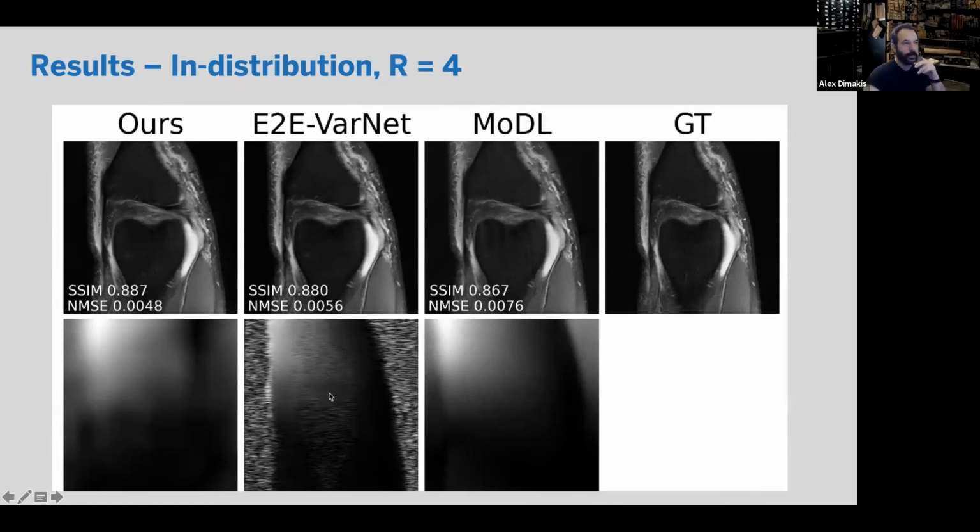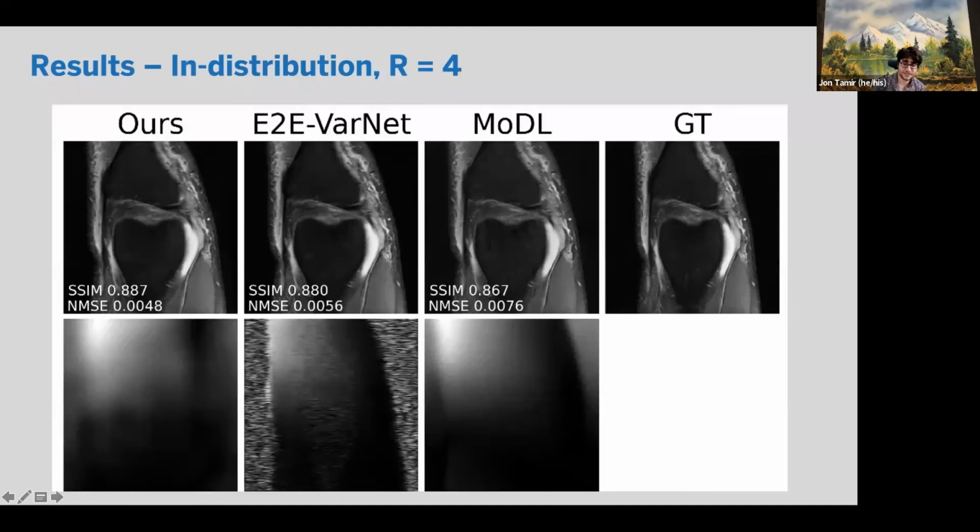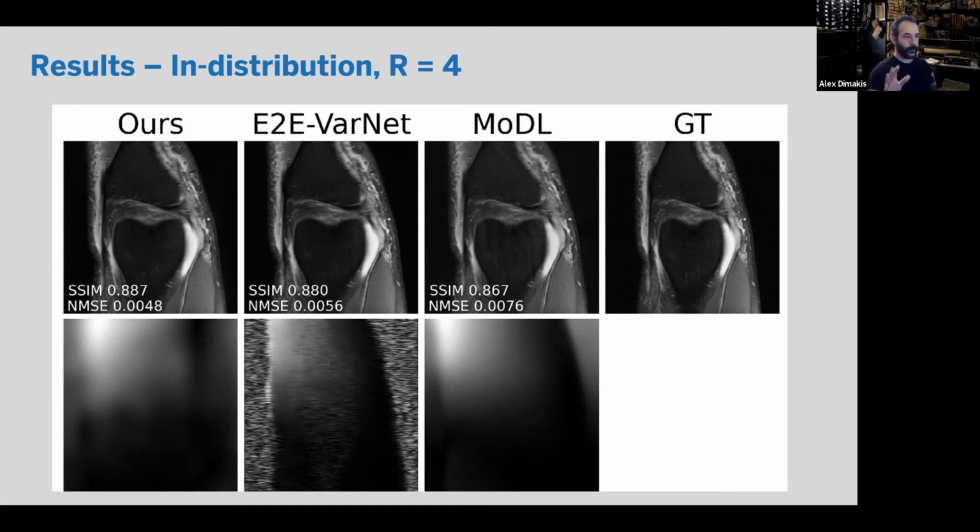John, sorry, stupid question, but for me to understand, how many sensitivity maps are there? Are there as many coils as sensitivity maps? Yeah, that's a good question. There are as many coils as sensitivity maps. So each coil has this particular sensitivity profile. And so we can represent that as its sensitivity map. Is the model that there is a real image and then every coil sees the real image point-wise multiplied by the sensitivity map?